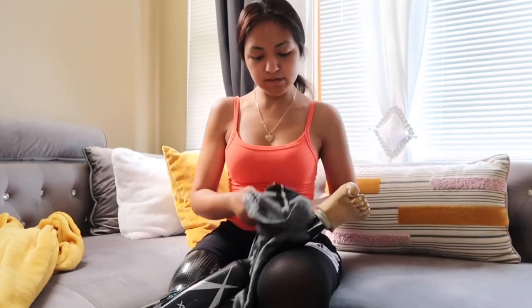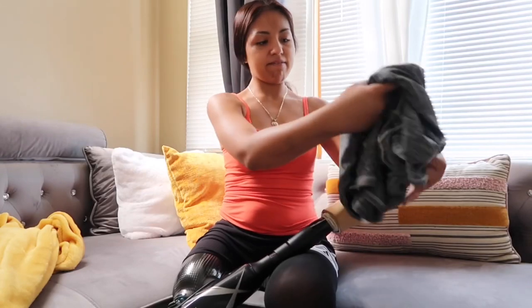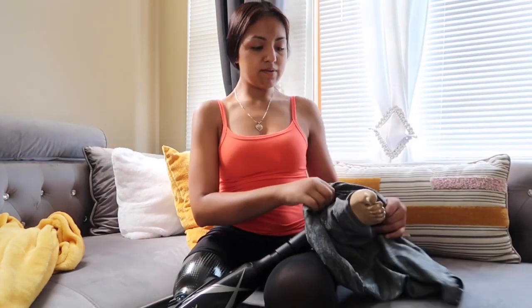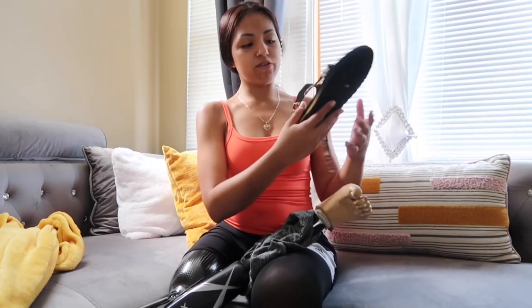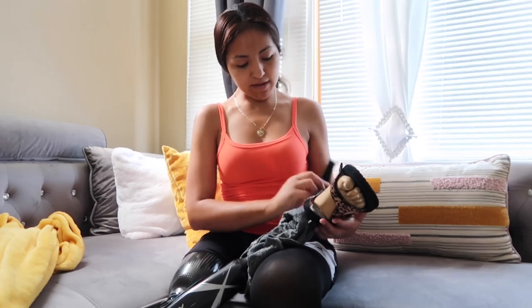I'm going to just show you. Take the shoe off first. Take my pants off, twist it, and there, I'm all done. Now to put them on, I press the rotator, twist it, and do the same exact thing like how I took them off. First I put in the prosthetic pants, and then I put on the shoe, because it makes my life easier. That way I don't have to rotate my leg again.